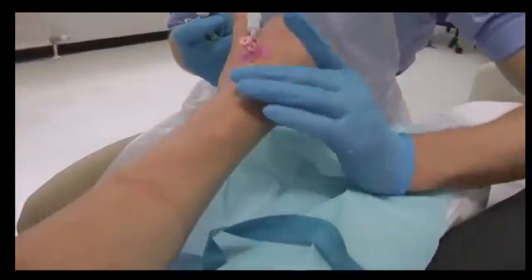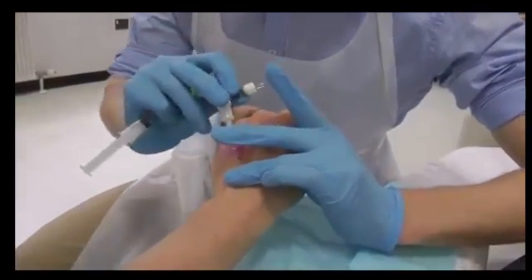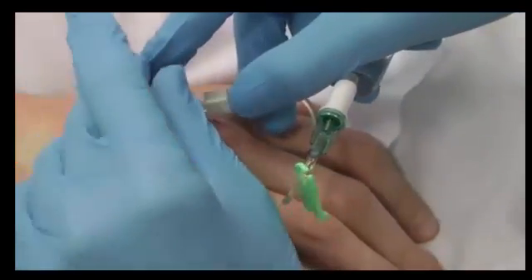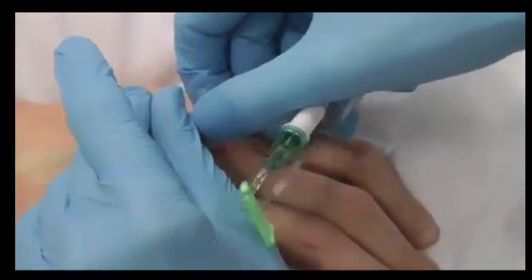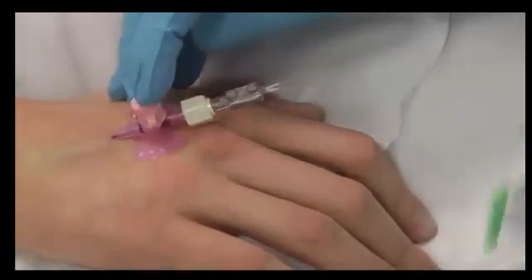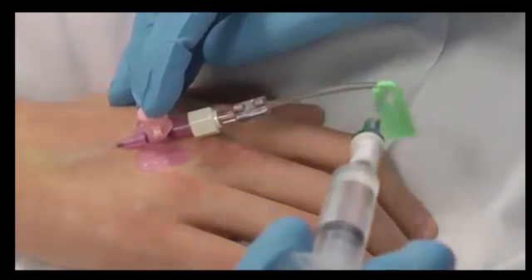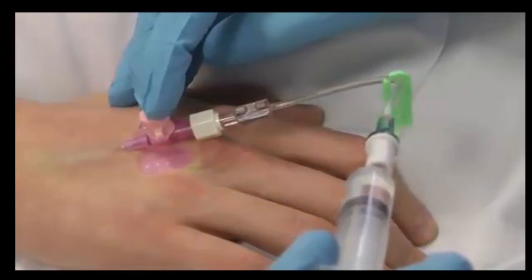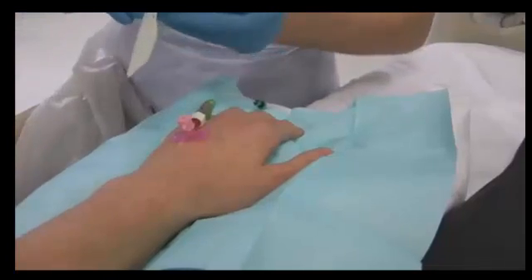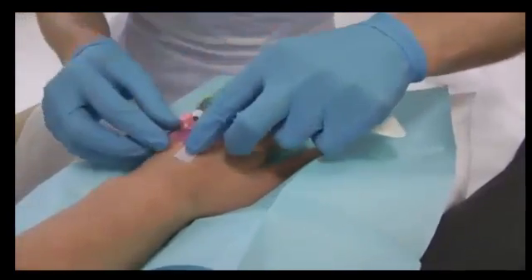Holding the cannula securely, occlude the vein and raise the arm to ensure there is no blood loss. Attach the bionectar and flush. Gently inject the flush, making sure there is no swelling or pain around the site as you do this. Now secure the cannula using the strips of tape over the wings, making sure you don't obstruct the view of the entry site.